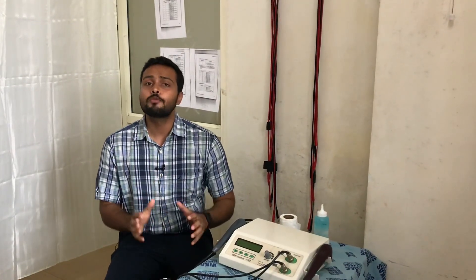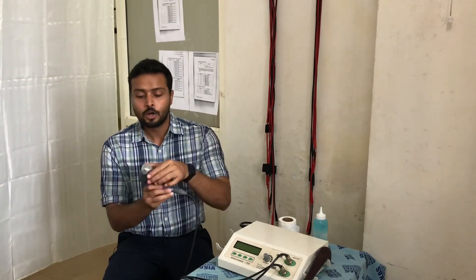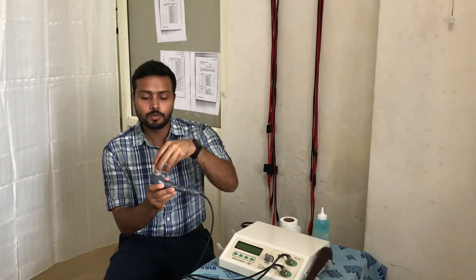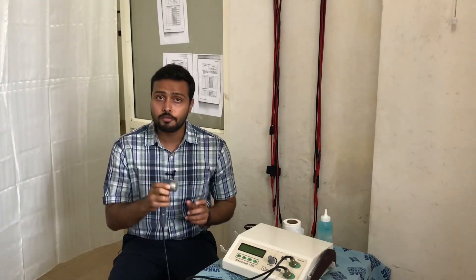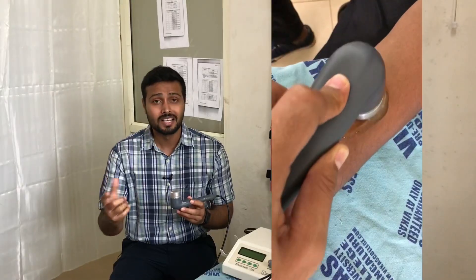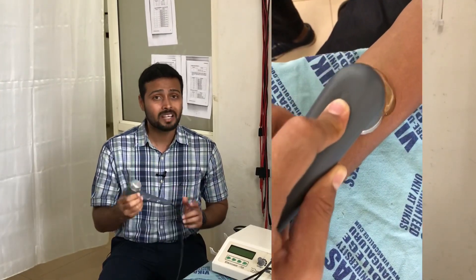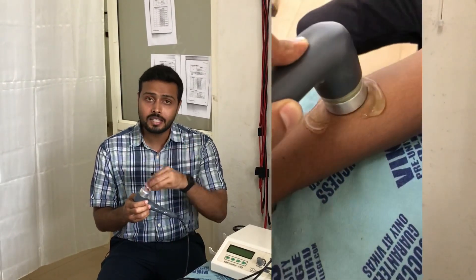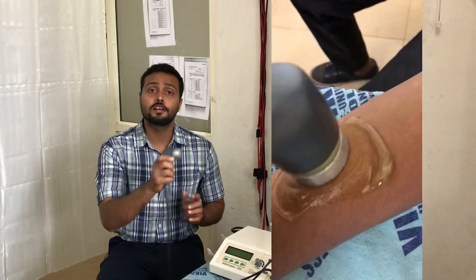Let's begin by understanding what ultrasound is and how it works. This equipment has one ultrasonic head with a metal fixed over it, and inside there is a crystal exactly the size of the head. The area we can treat is always determined by the size of the ultrasound head — for example, if the head is two centimeters square, we can treat four centimeters square of the patient's area.